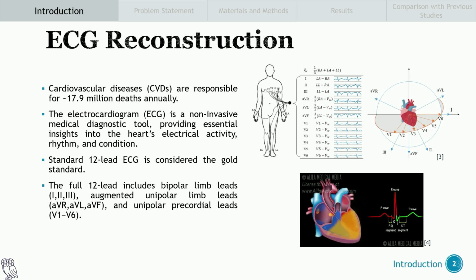So if you look at this short video, you can see that by looking at one individual heartbeat ECG signal, you get information about specific parts of the cardiac cycle, and that's why looking at these time series can be very informative for cardiologists as one of the initial assessment steps.